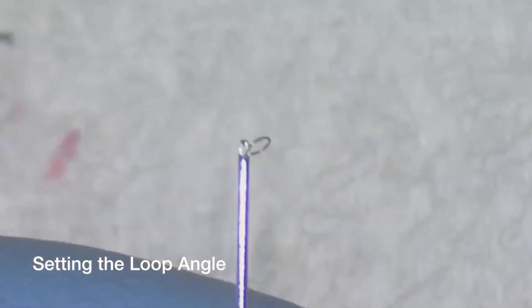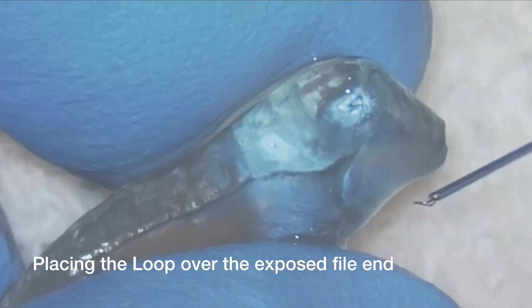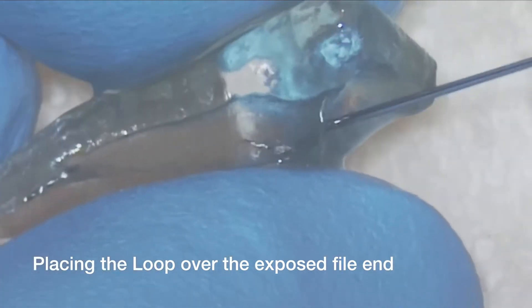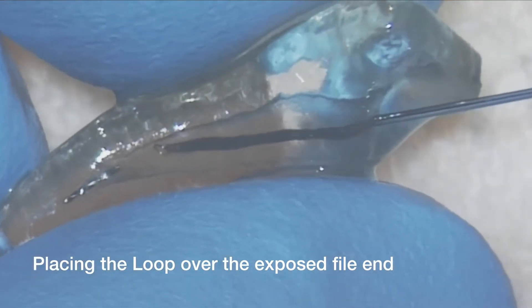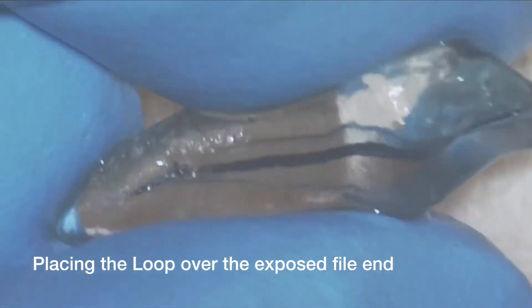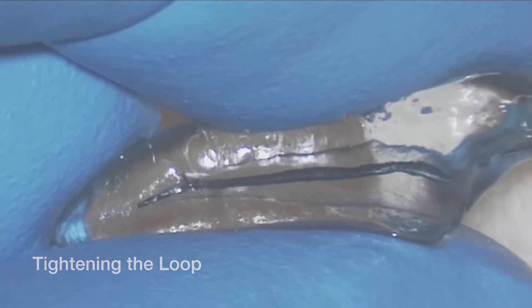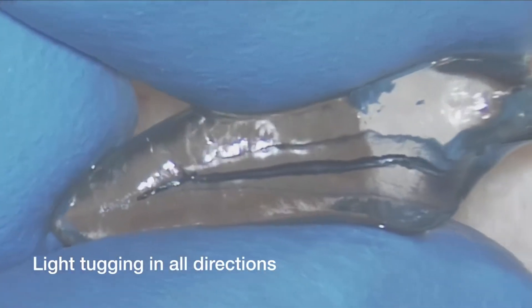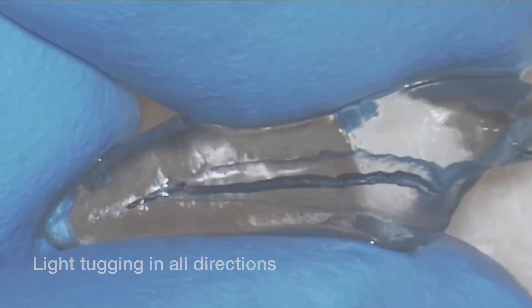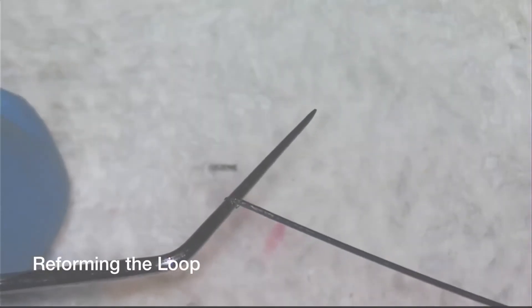I'll show you how to set the loop angle before you release the loop from the explorer — you want about a 45-degree angle, and it'll slide right down the canal over the broken file segment. Then you retract the red button. See the little loop coming in — it's got just the right angle. I expand just a little bit, I'm around it. Tighten the loop up — you can see it tighten right there. Now I'm going to lightly tug on it. I've already released from it, so I reform the loop.